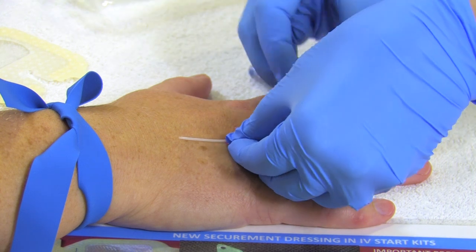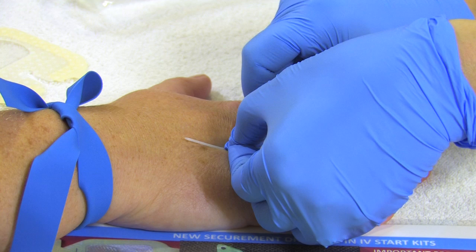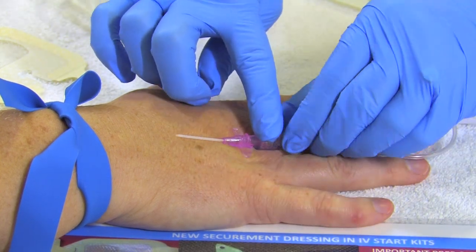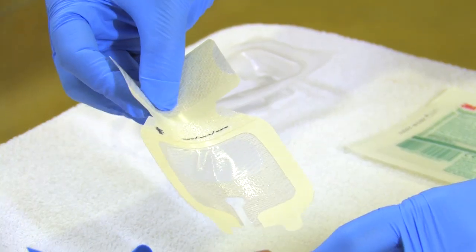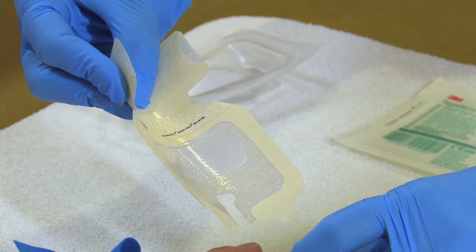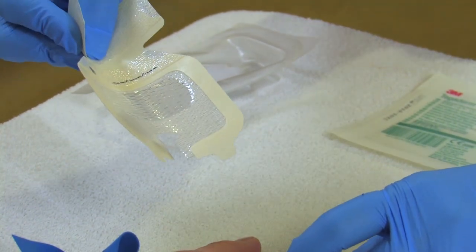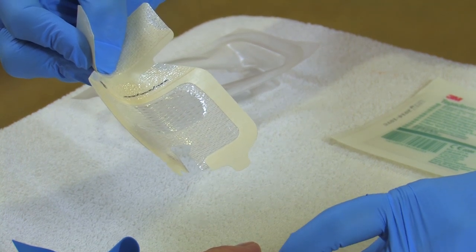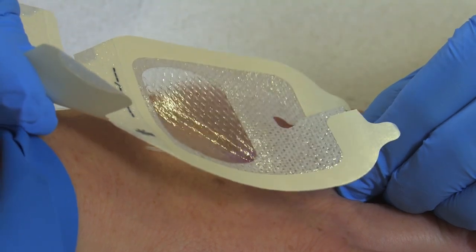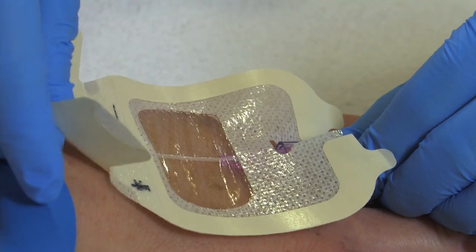And I'm going to connect my IV tubing. Okay. And I'm going to hold it steady. So you want to hold the 3M like a piece of pizza, and you really want to pinch it a little bit so that it's easier to get the notch to cover only the hub of the catheter, the colored area, not the luer lock device. So we're going to cover just the colored part, and we're going to lay it down.